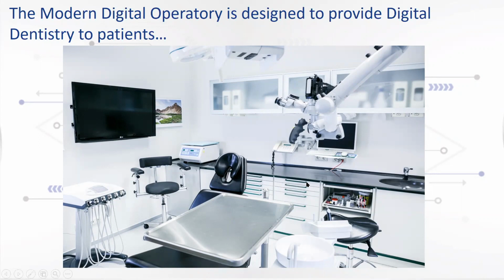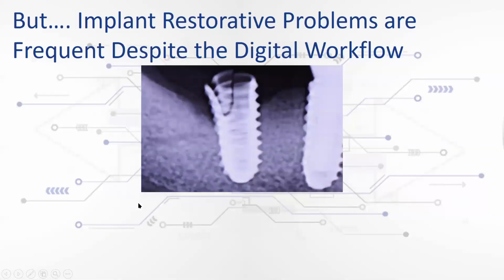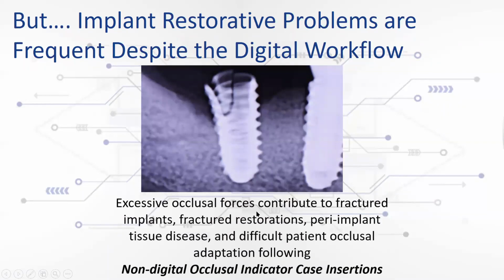And this is all in the hopes of providing incredibly high levels of precision, really surrounding what has become known as the digital workflow. And many of you are practicing in this newly evolved prosthodontic method, this digital workflow. But it's interesting, despite the digital workflow, implant restorative problems are increasing. And this is really due to occlusal force management.